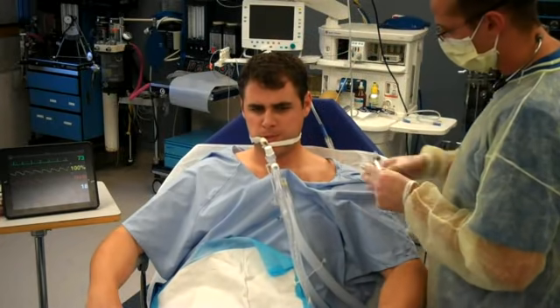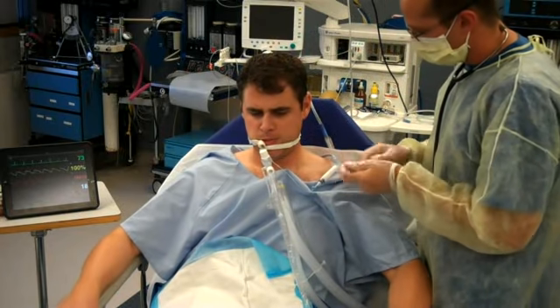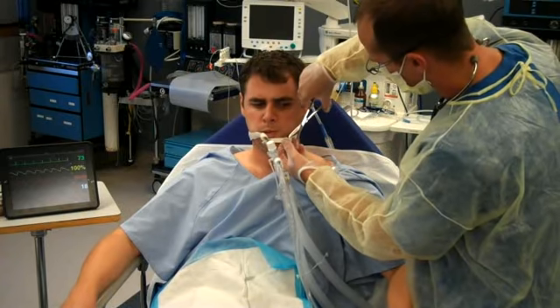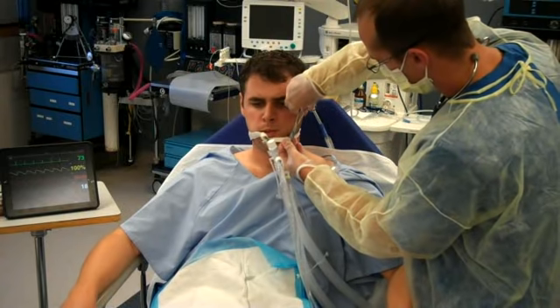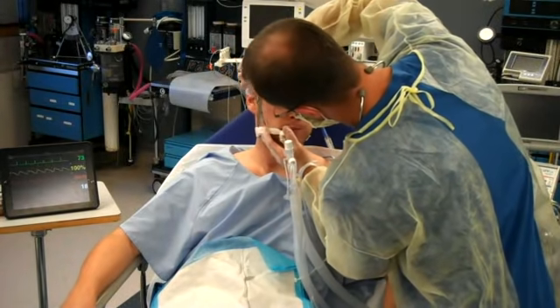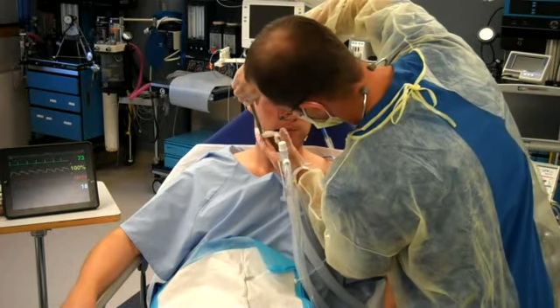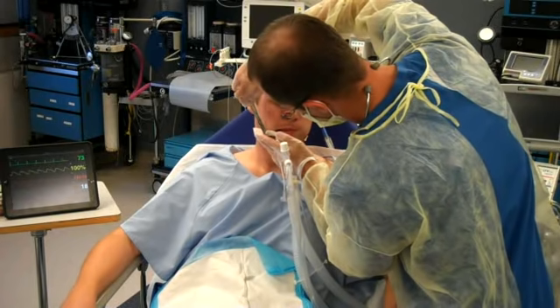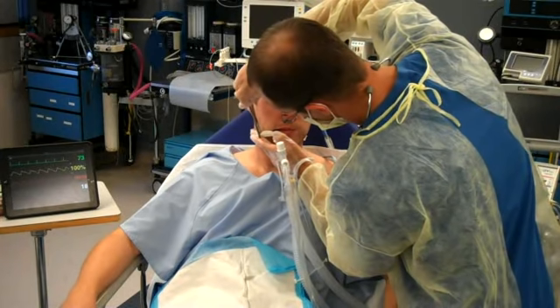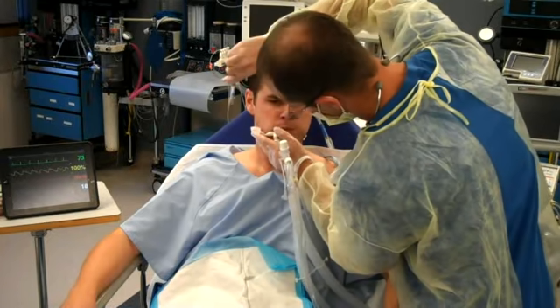I'm just going to get all this stuff ready. You've got some tape on your face — I'm just going to cut that a little bit. I want you to stay nice and still for me. Just turn your head this way a little bit.